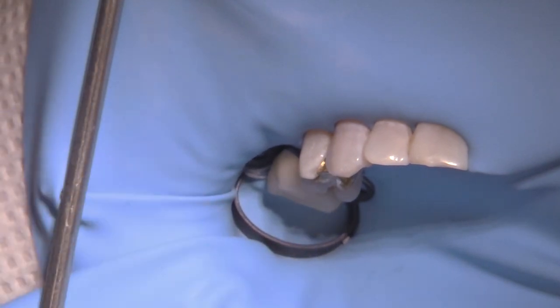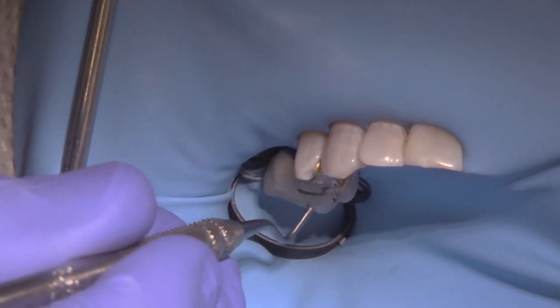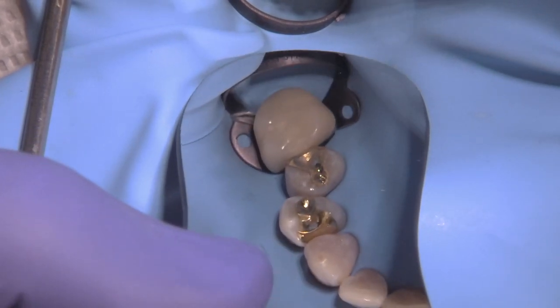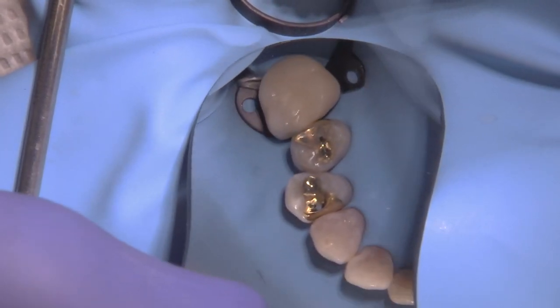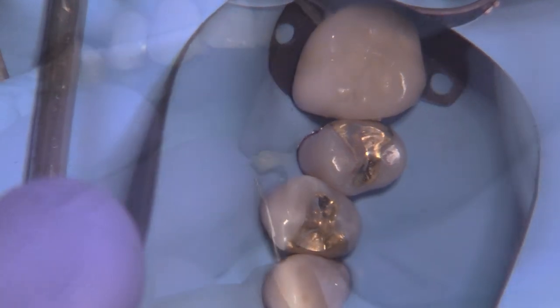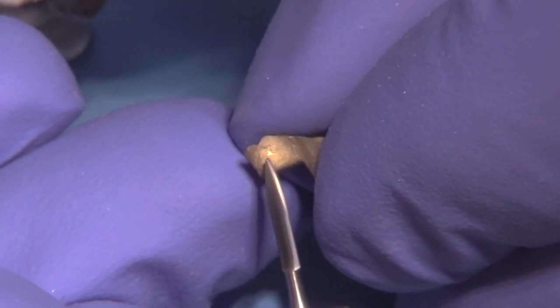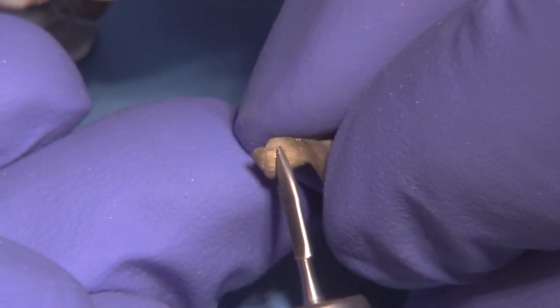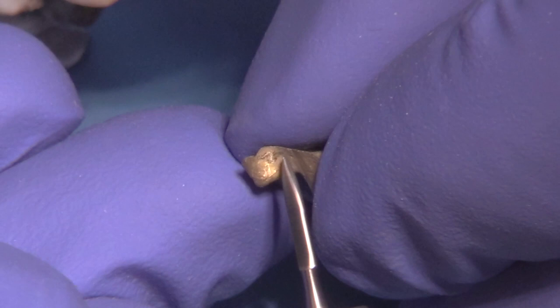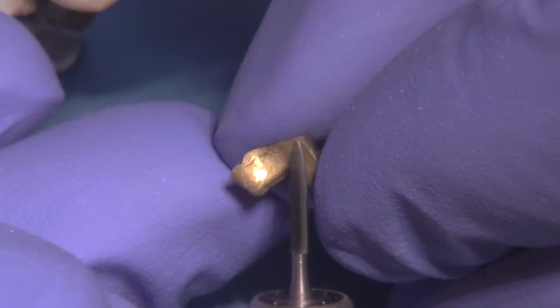We'd like to try them in first and make sure that they seat completely. It is a little difficult to remove the castings if you push them fully down, so you have to trust that your lab work is correct. Check the margins and contacts, make sure everything is okay, then look on the inside of the castings for any rub marks. I like to use the H48L burr to remove any little shiny spots — these are indications where the casting may be rubbing and may hinder full cementation.